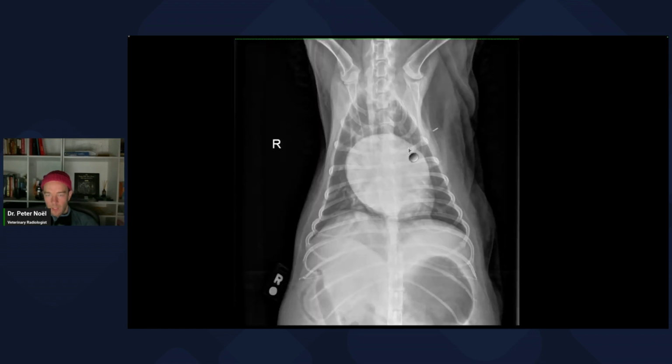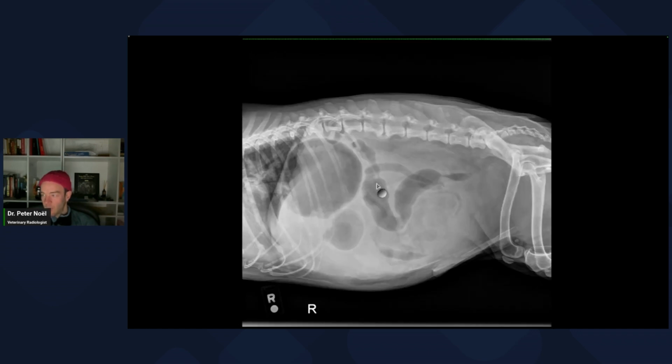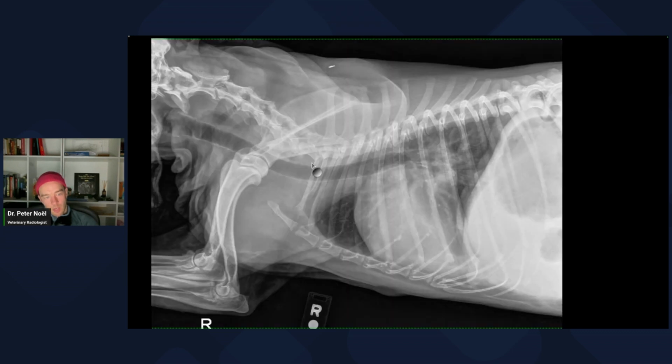I'm going to go over here to the VD. Here's the increased opacity in between the principal bronchi, or main stem bronchi, if you will. So here's the trachea, the carina, the right caudal lobar bronchus, and then the left over here. This is increased soft tissue opacity in the area of the left atrium. We know it's the left atrium and not, say, tracheobronchial lymph nodes, because when you go back over here, this trachea goes way up, and this area is not displaced ventrally. If you had a large tracheobronchial lymph node, it would be jamming this down, not swooshing it up.